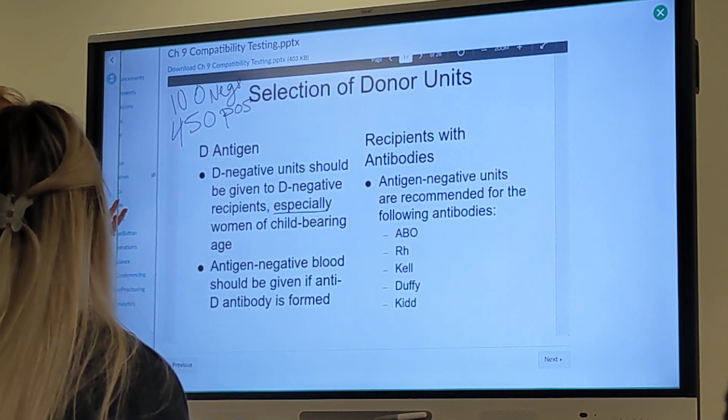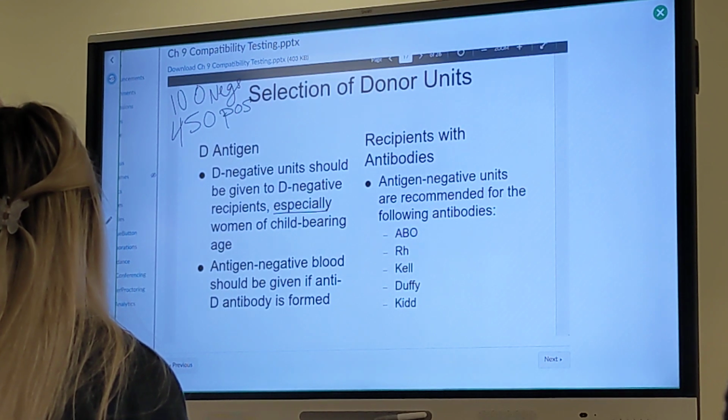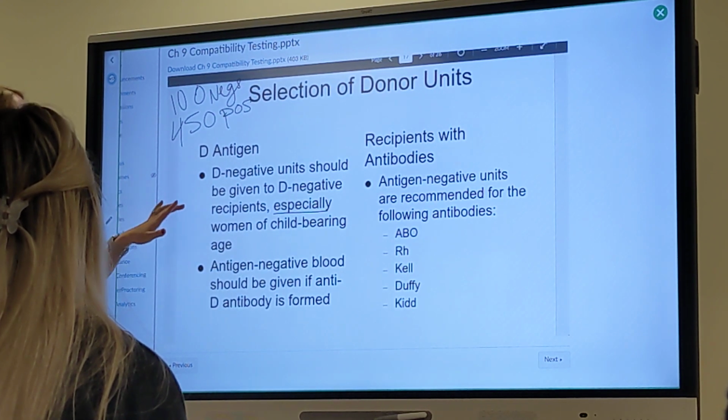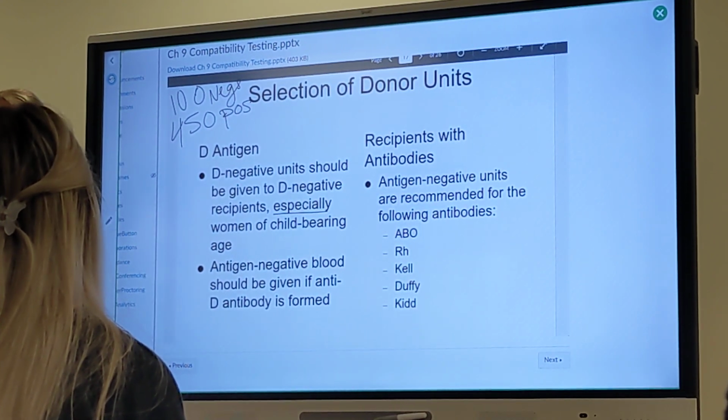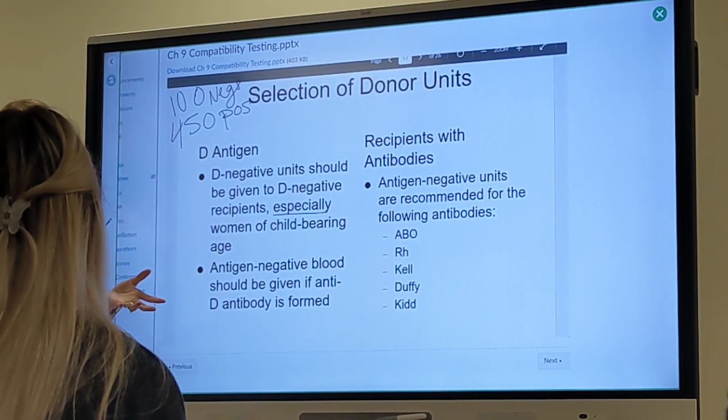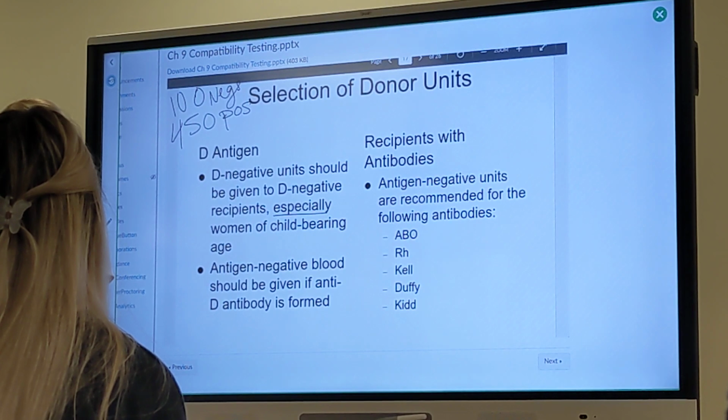So if we knew they were in surgery for a hysterectomy, you have to prove that they're having a hysterectomy. Sometimes hysterectomies do use blood. It's not that common, but I have seen it happen. We would switch their type if we were low on blood, because 10's not many. If I got down to 7, I started to get nervous.